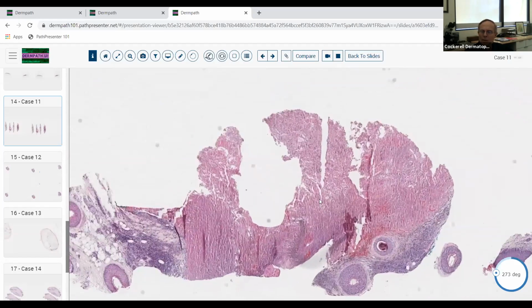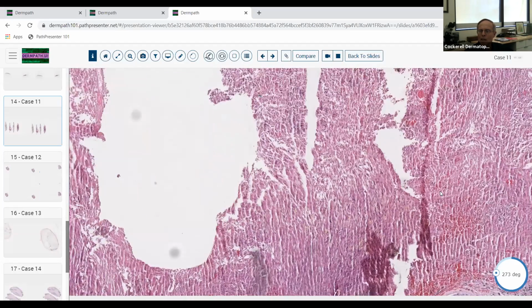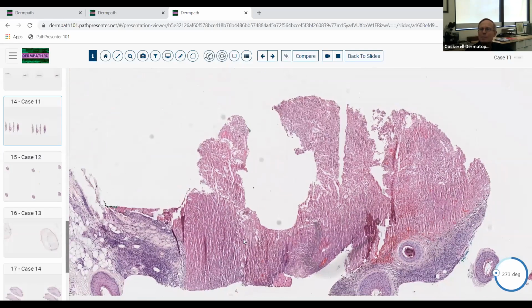We've got a zone where there's all this necrosis. Now, whenever you see necrosis en masse in a melanocytic lesion, you should immediately be concerned about that. Benign melanocytic lesions don't undergo necrosis en masse. They just don't do it. So whenever you see necrosis en masse in a melanocytic lesion, you should say that's very much a red flag that it may be malignant melanoma.